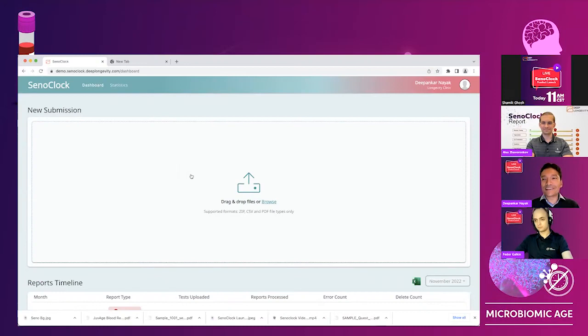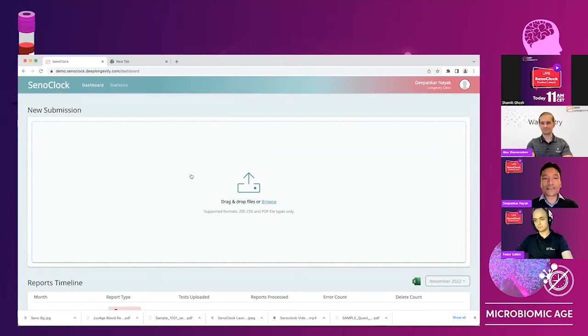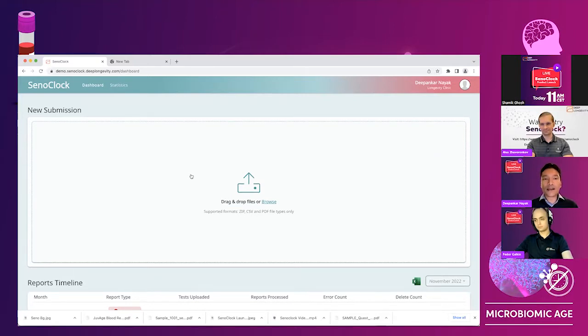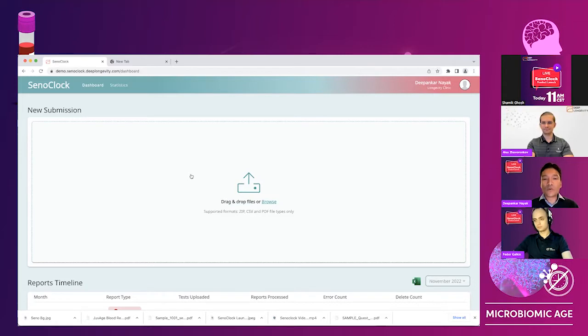So I'll go directly to the application and start my presentation by showing everyone Senoclock. As you can see, this is the platform that we have built, which is the home for all our aging clocks.